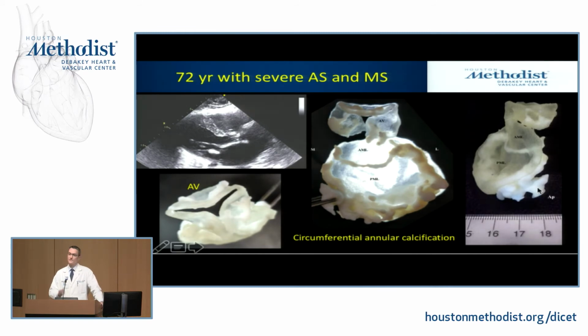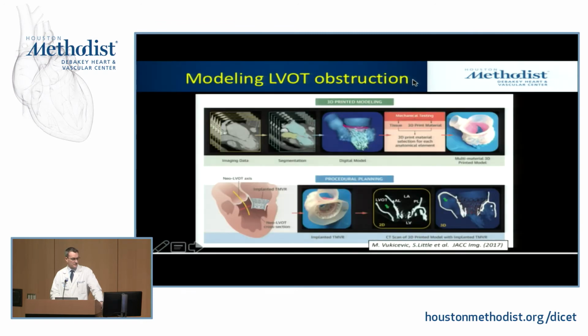This was not quite prohibitive. Well, this is probably prohibitive to remove the calcium in a surgical mitral valve replacement, so based largely on this model, the decision was made to put a Sapien inside this calcium ring. So, surgically implanted: take out the native leaflets, leave the calcium, and put a Sapien in with a couple of sutures to hold it there. That's how this patient got a mitral valve replacement without attempting to remove calcium. They ran all the way down into the posterior wall of the LV. So that's a very real-time and recent example of how we use some 3D printing.